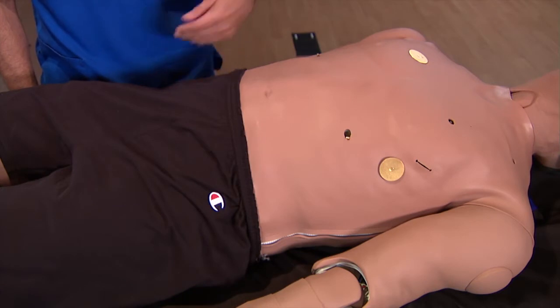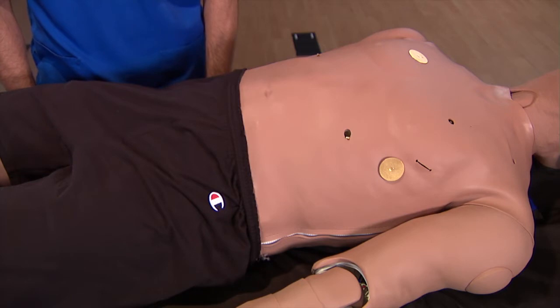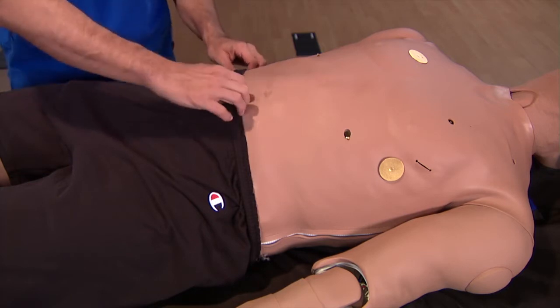The battery is located inside Mediman's abdominal cavity, on the right side. You'll need to unzip the skin and remove a few components to replace the battery.